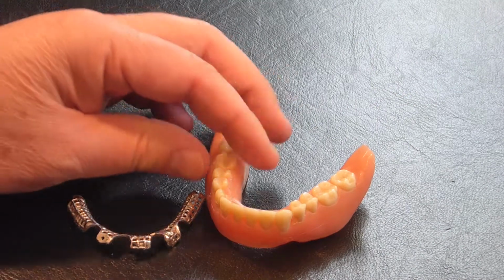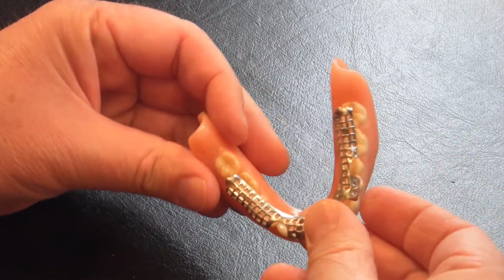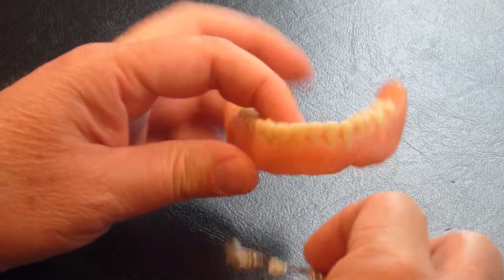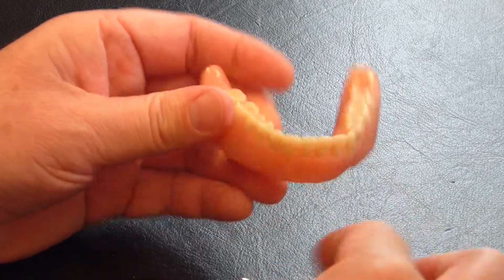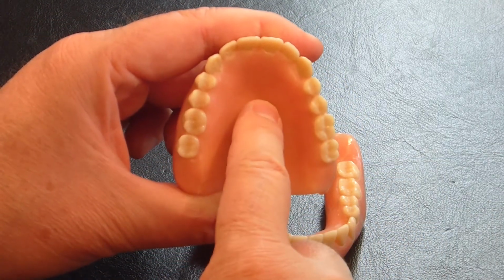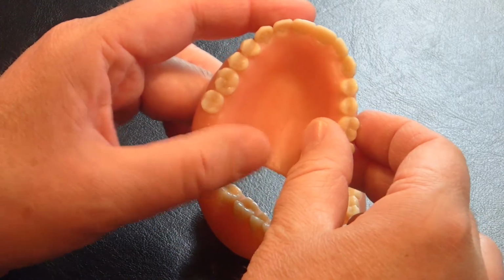If someone still has some of their teeth, say they still have their upper teeth and just need a denture on the lower, we can also strengthen the denture itself with a metal framework that gets embedded inside the plastic, so you don't see it. You don't see it, but it gives it a lot more strength, so you're less likely to crack the denture. And the same thing can be done for the upper denture as well, where there's a metal framework. You could see it on the roof of the mouth side, but otherwise you don't see it when you smile. And that just helps make the denture stronger, a little bit more crack resistant.